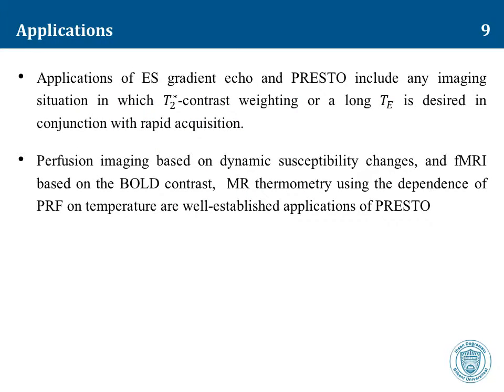As I mentioned in the beginning of my presentation, applications of ES gradient echo and PRESTO include any imaging situation in which T2* contrast weighting or a long TE is desired in conjunction with rapid acquisition. Perfusion imaging based on dynamic susceptibility changes and fMRI based on the BOLD contrast are relatively well established applications of PRESTO.